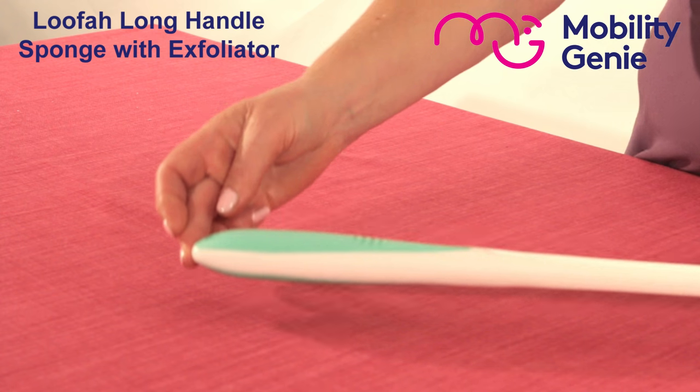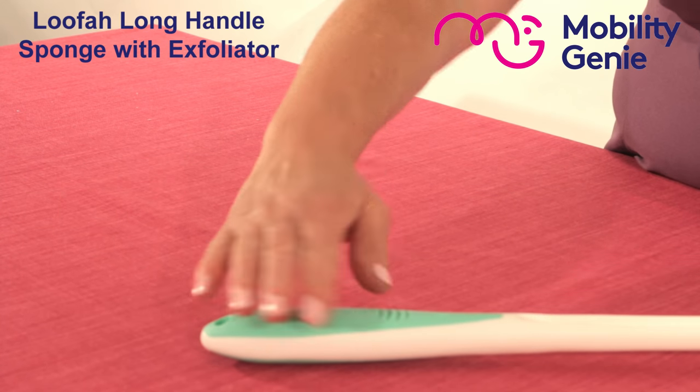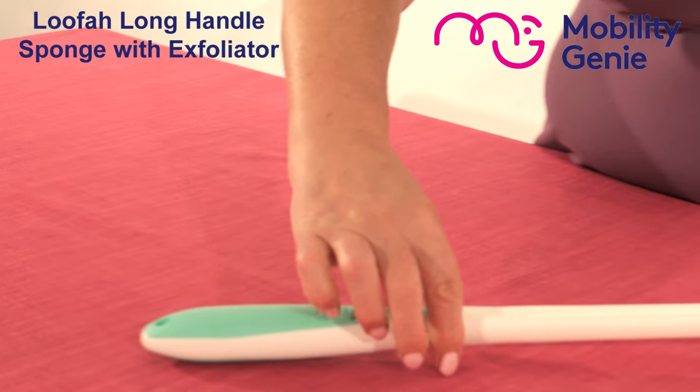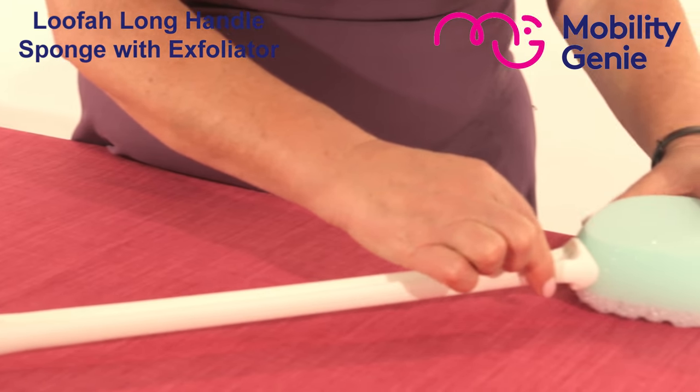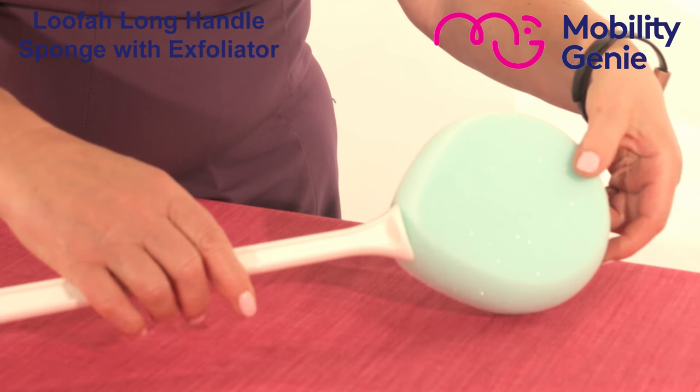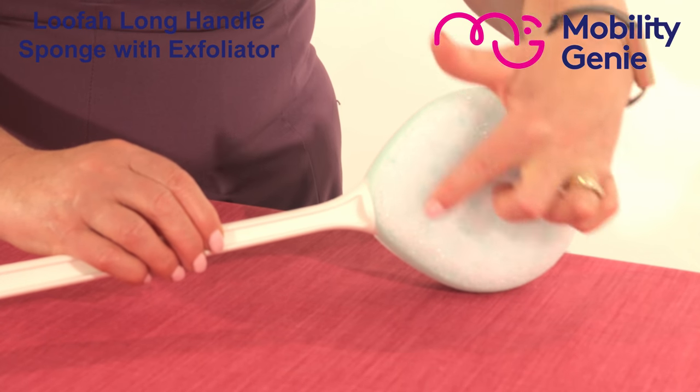You can see that the handle is a built-up handle that allows for easy grip. It's got an extra long handle that leads up to a large firm sponge pad, with an exfoliating Lofa on the reverse side.